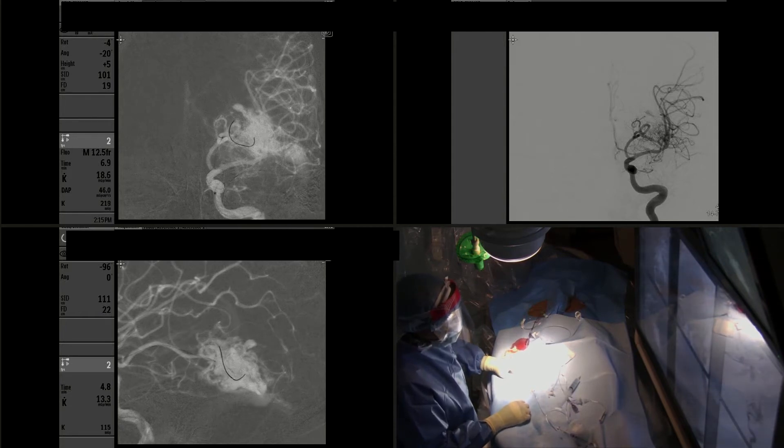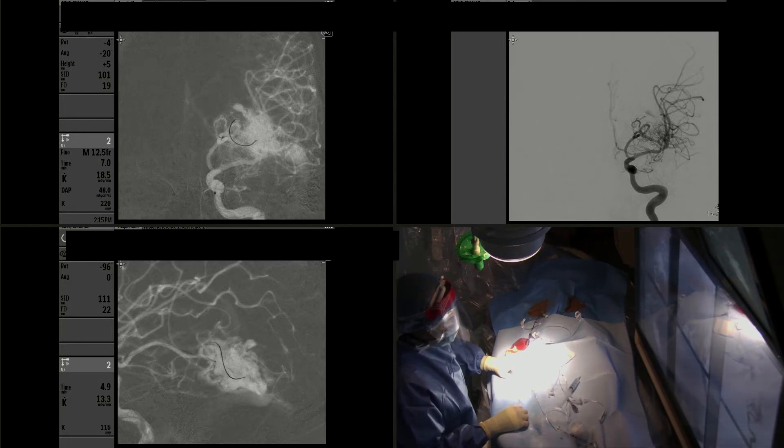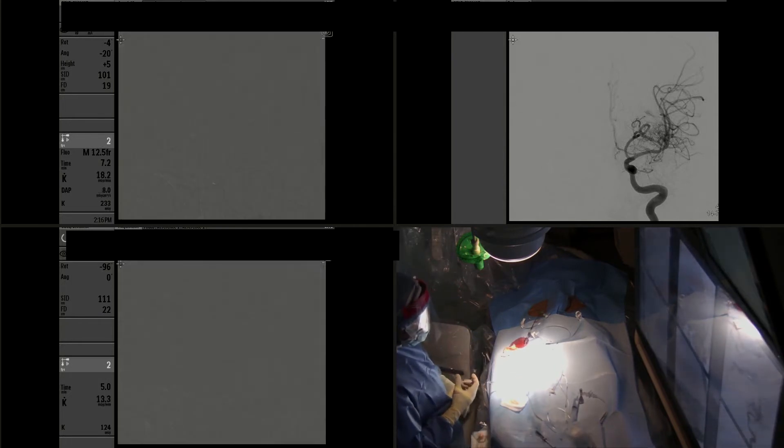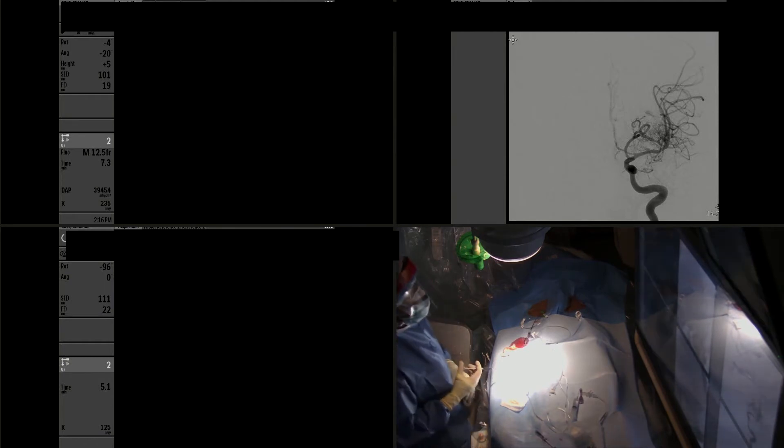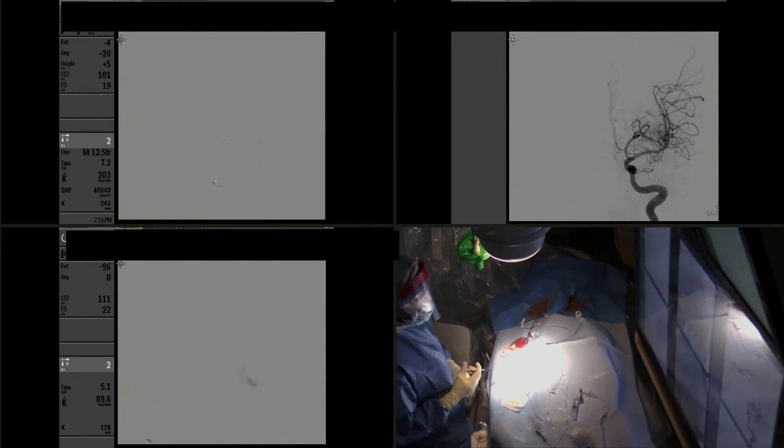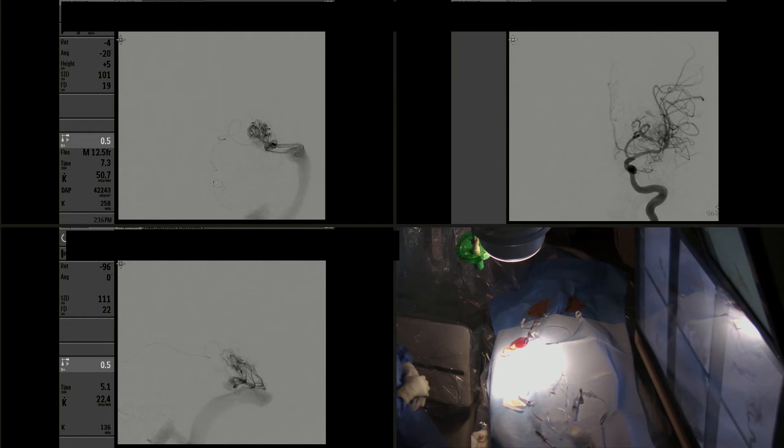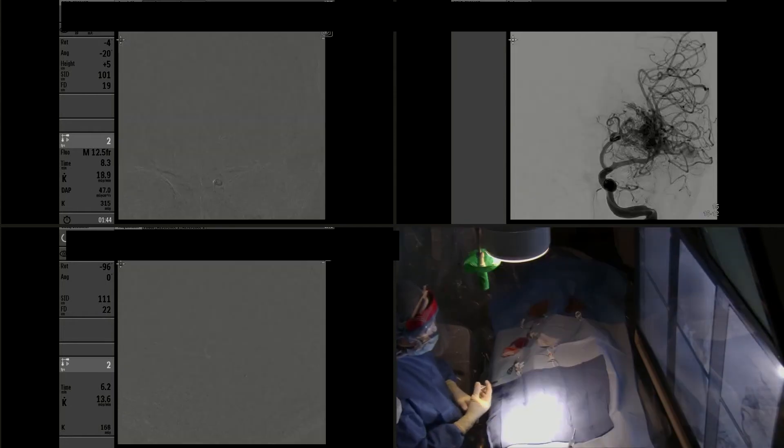After obtaining the desired position, we did an injection of contrast of the distal MCA branch. We checked flow initially to make sure there's no contrast stagnation or normal parenchyma blush, and then we injected and did a DSA of the left MCA. There's opacification of the arteriovenous malformation nidus draining through the left transverse sinus and sigmoid sinus. There's no evidence of normal parenchyma blush.